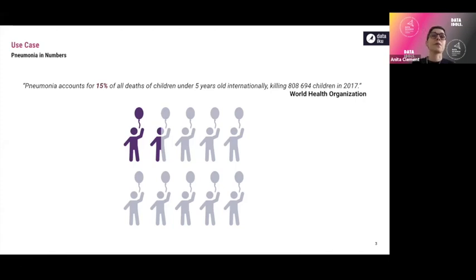And the thing is, accurately diagnosing pneumonia is quite complex. First, the radiographs need to be reviewed by highly trained experts, and then there is a confirmation through clinical history, but also vital signals and some additional laboratory exams. So it's quite a long process.